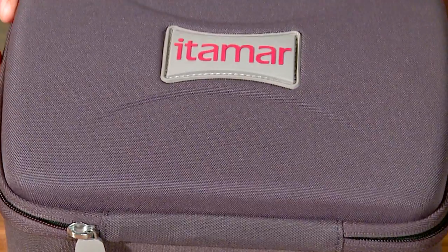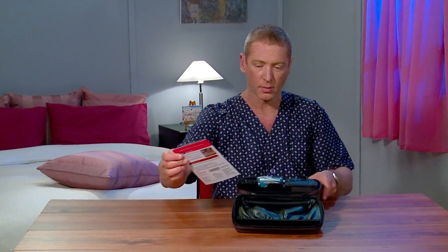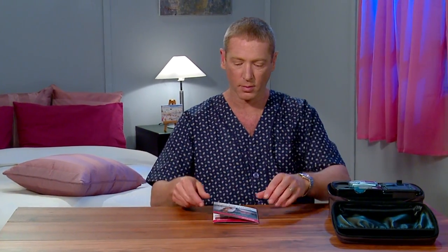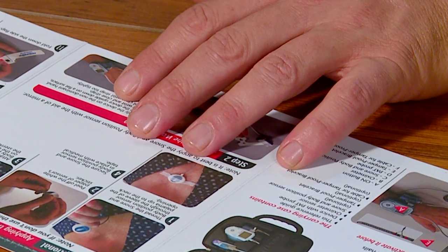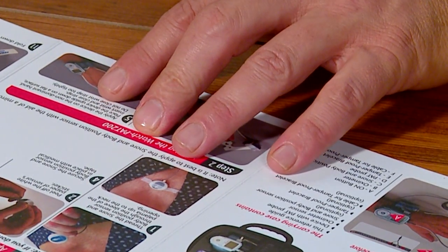Open the WatchPat case. You will find a helpful illustrated guide in the side pocket. Make sure the fingernails of that hand are trimmed and without polish. Remove all jewelry and avoid hand cream.